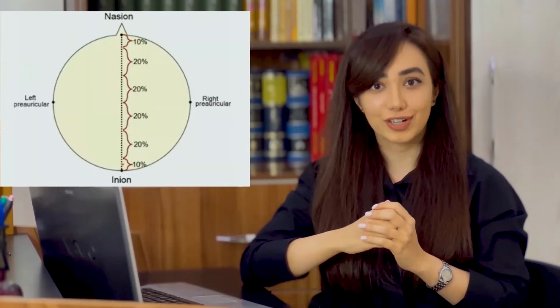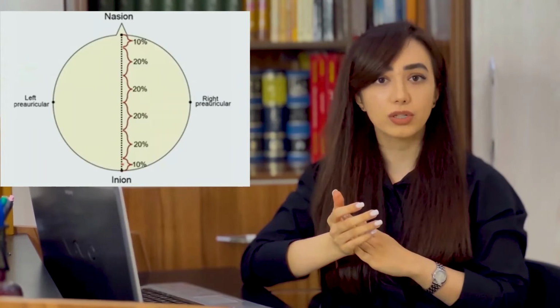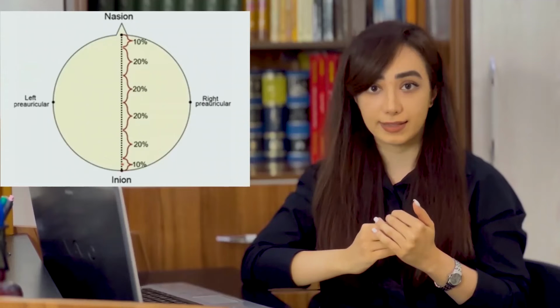As you can see in this picture, the other electrodes are located based on 10% or 20% interelectrode distances. Each site has a letter to identify the lobe and a number or another letter to identify the hemisphere location. The letters F, T, C, P, and O stand for frontal, temporal, central, parietal, and occipital. Note that there is no central lobe though, but this is just used for identification purposes.